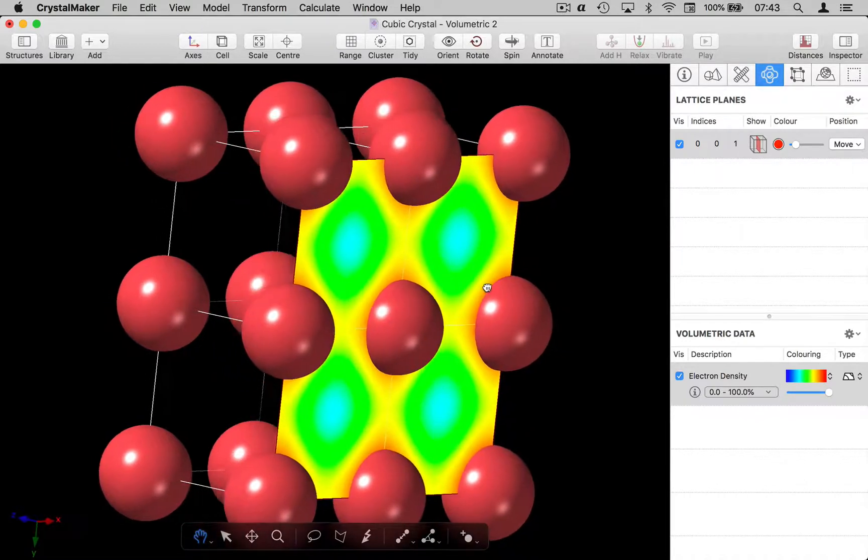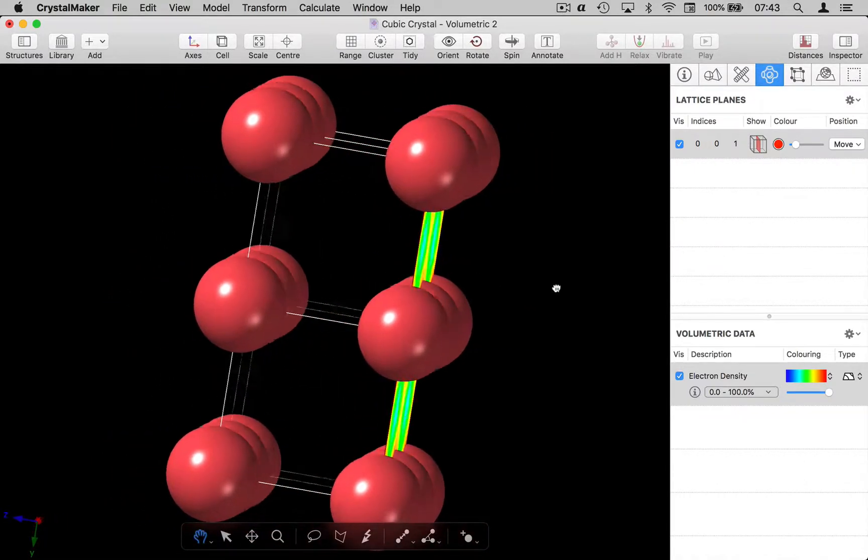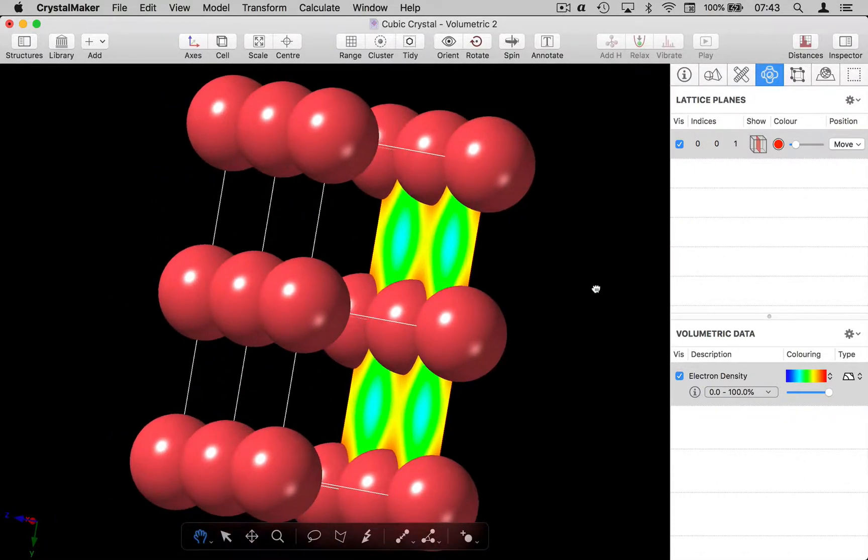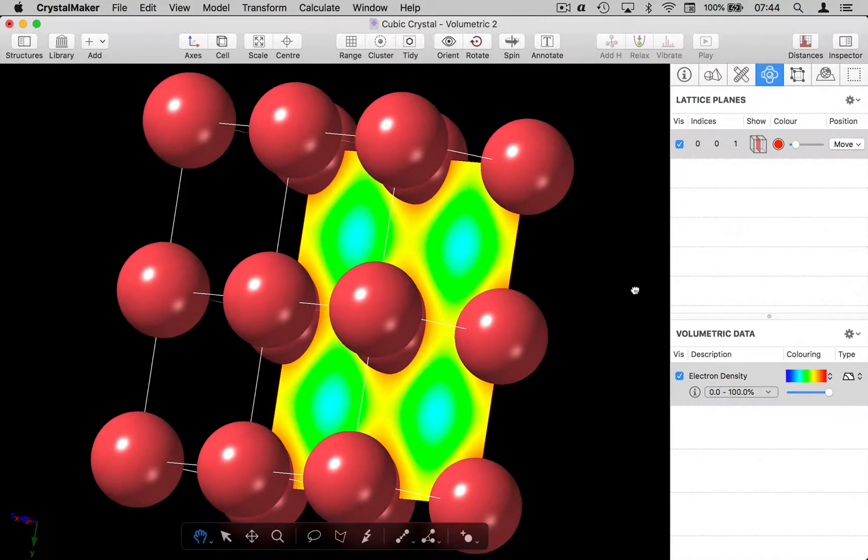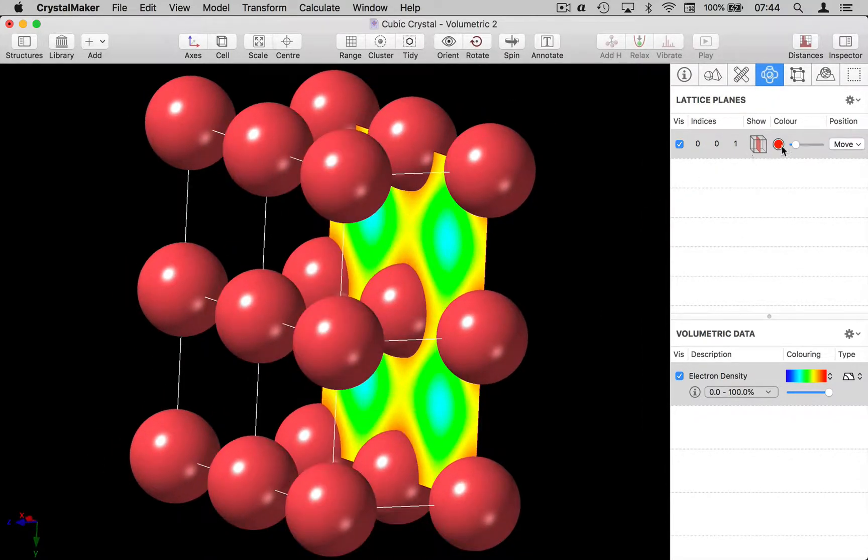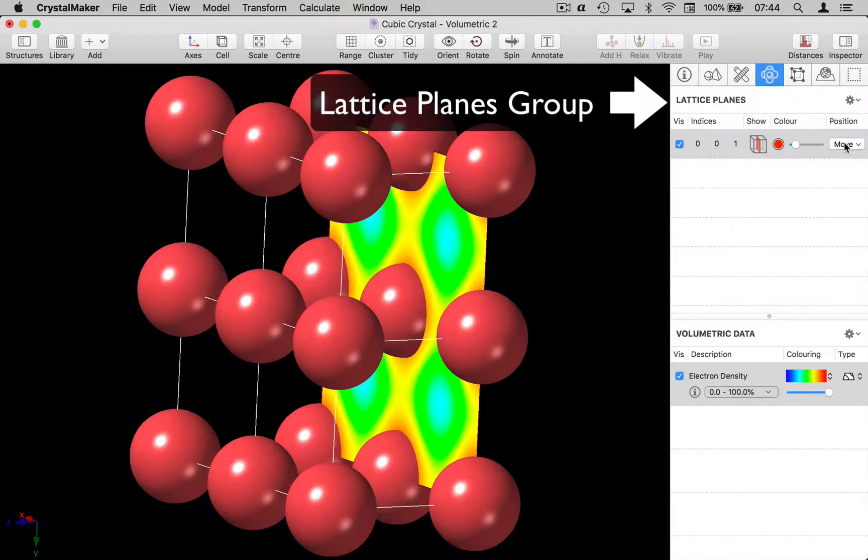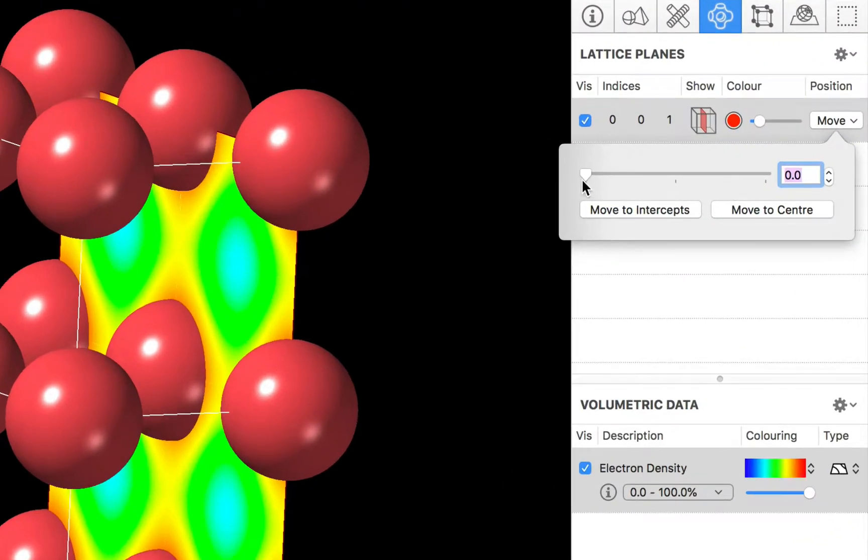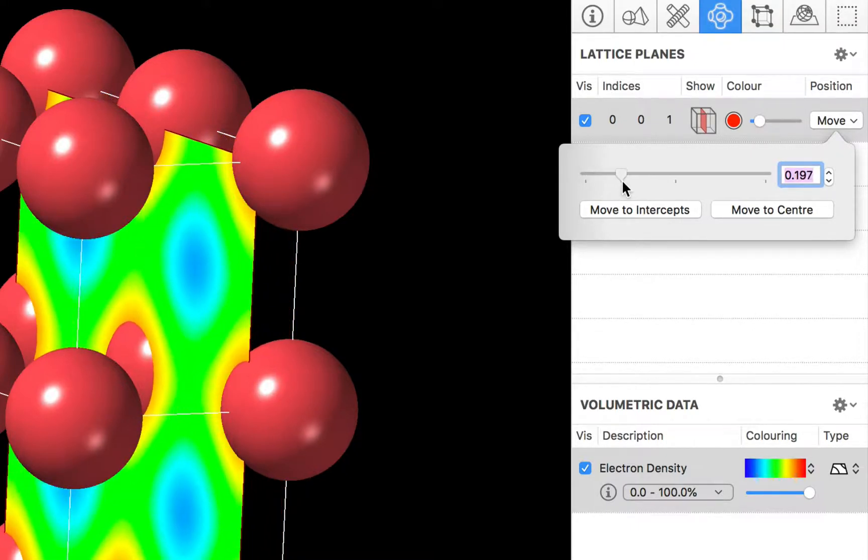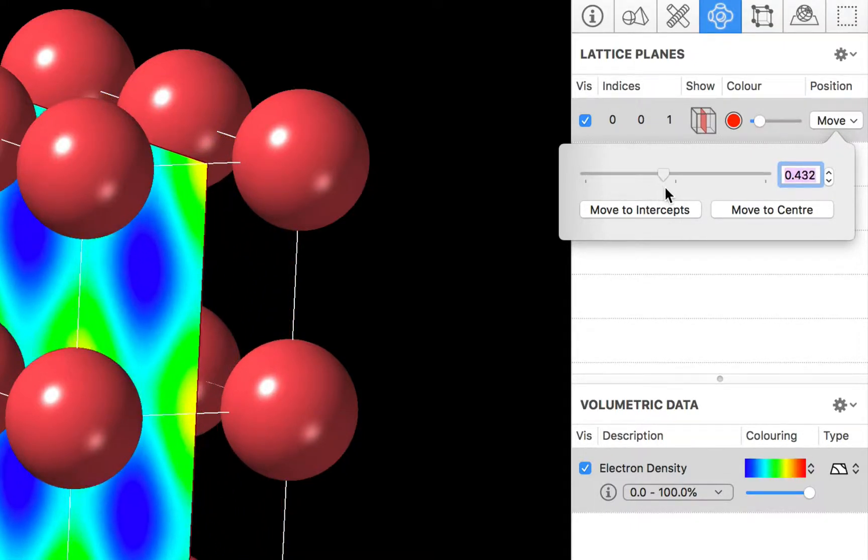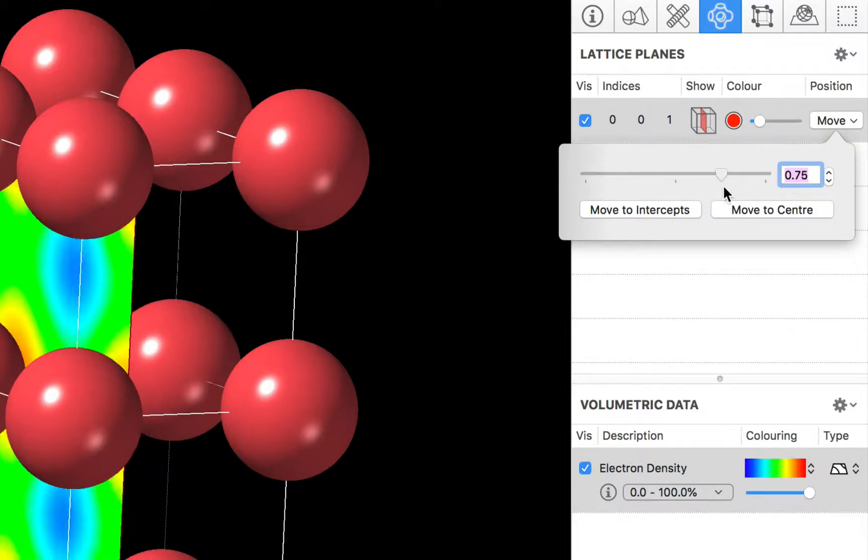So as I rotate the model you can see a slice of the electron density in the crystal. I can take that lattice plane and using the lattice planes group which is also in the volume inspector I can move that through the structure and see how the electron density changes.